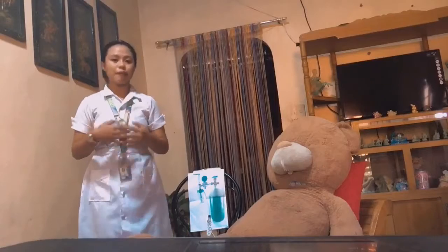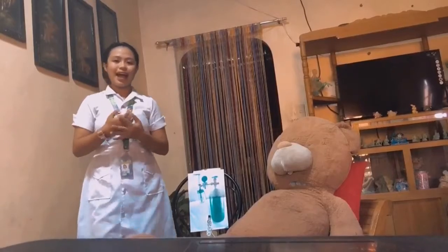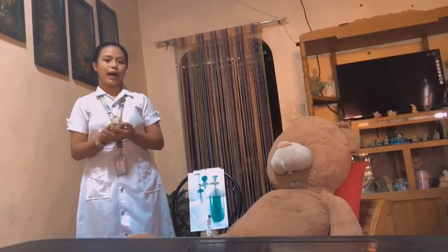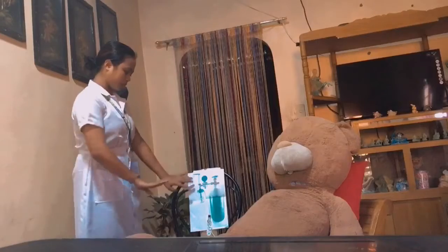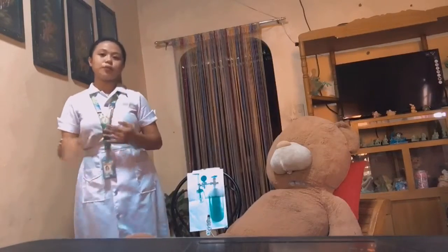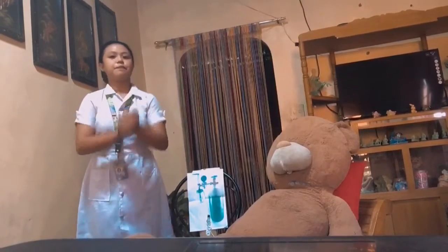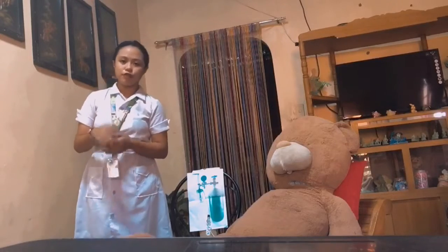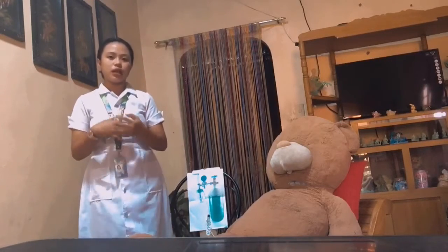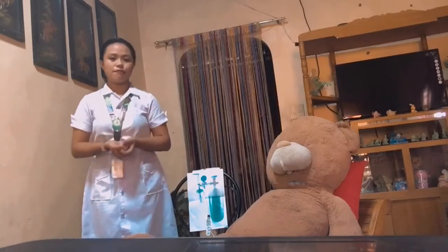Now, we need to set up the equipment and the humidifier. First, we need to attach the flow meter to the wall outlet or tank. The flow meter should be in the off position if needed. Now we need to fill the humidifier bottle. This can be done before coming to the bedside. Next, we need to attach the humidifier bottle to the base of the flow meter. Next, we need to attach the prescribed oxygen tubing and delivery device to the humidifier.